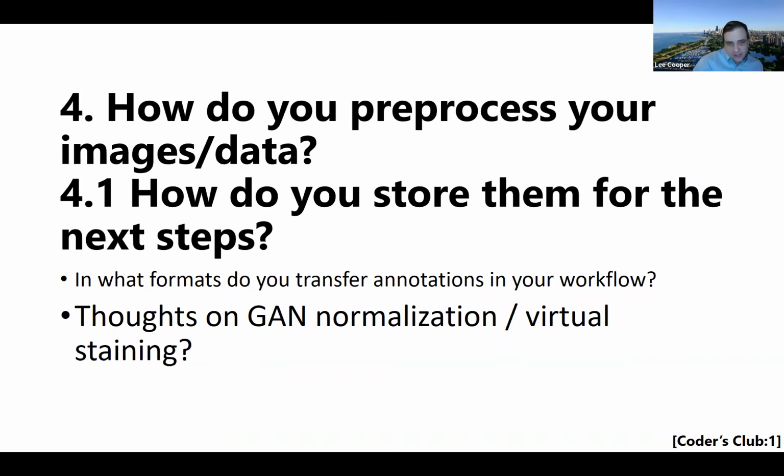So the GAN thing is interesting. There's a paper that I really like from Stanford that looks at irrelevant style transfer. Maybe people are familiar with this, but they took histopathology and they applied style transfer from classical paintings and things as augmentation during training. And I think during training you have a lot of freedom to just make the images look however you want, and if it improves performance, that's good, right?